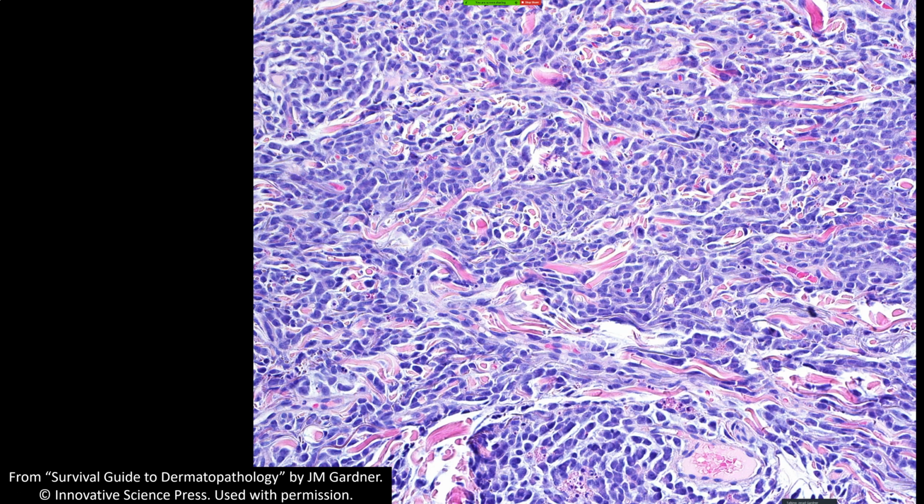Try to keep in mind that lymphomas can sometimes look like this. So if I'm not sure what it is, I might include a CD3 and a CD20 to cover B and T cells, a myeloperoxidase to try to recognize some blastic derivation. And then also there is a really rare thing called blastic plasmacytoid dendritic cell neoplasm, which to my eye looks, I don't know how to tell it apart.